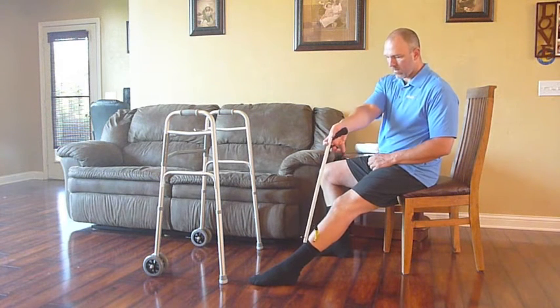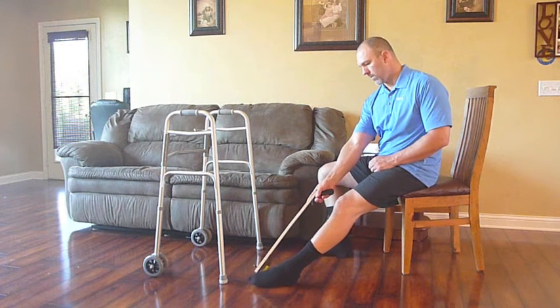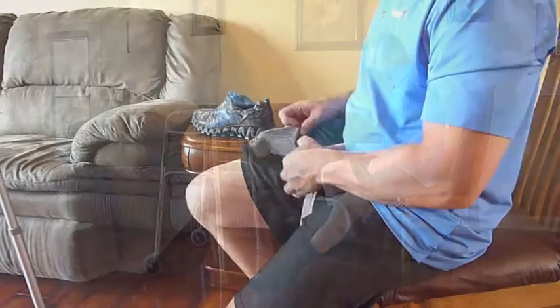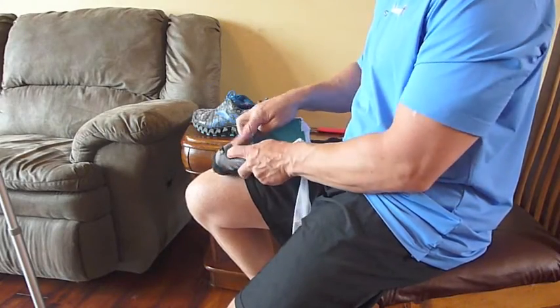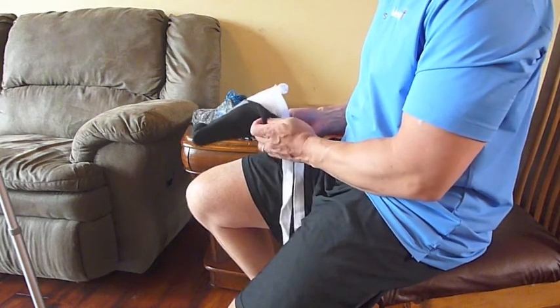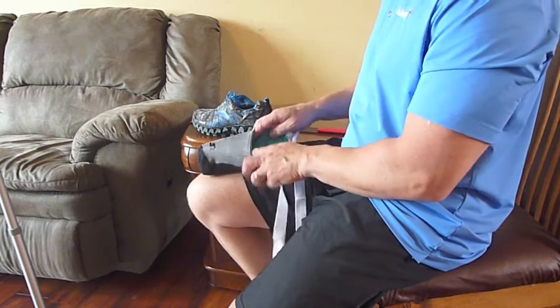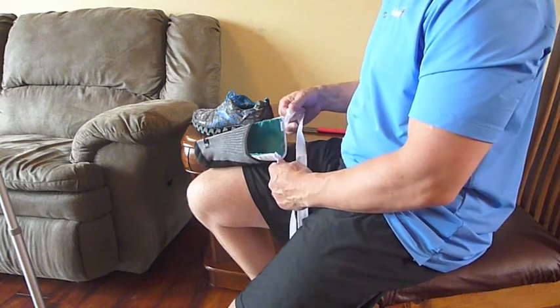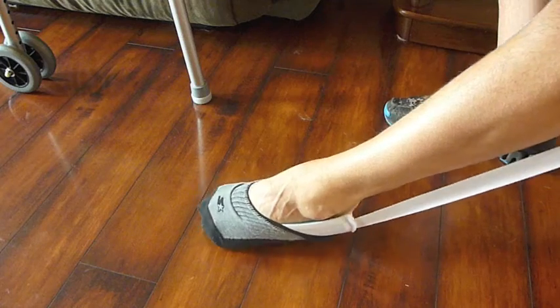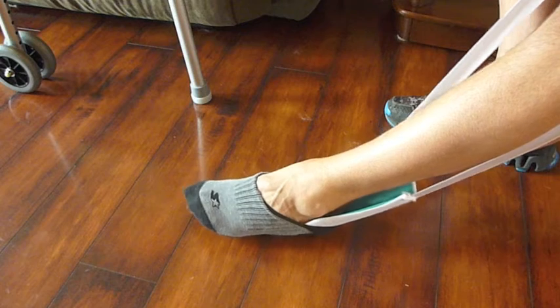It's recommended when dressing that you keep your reacher, your shoehorn, and your sock aid, as well as your pants, underwear, socks, and shoes in a reachable location. This procedure can be performed either with the firm plastic sock aid or the flexible sock aid such as this, and with short or long socks. This would be an example of a short sock. The procedure is the same, slipping the sock over the front of the foot and gently pulling it over the heel, making adjustments with the reacher as needed.